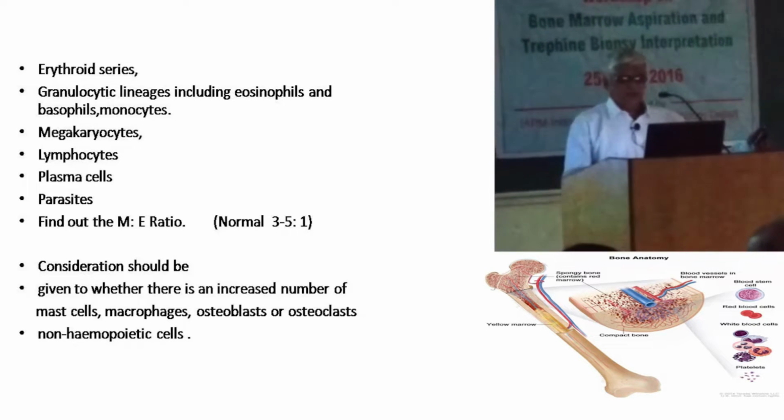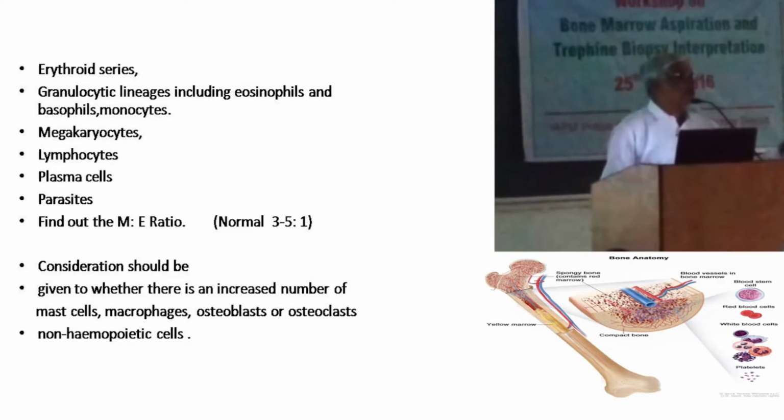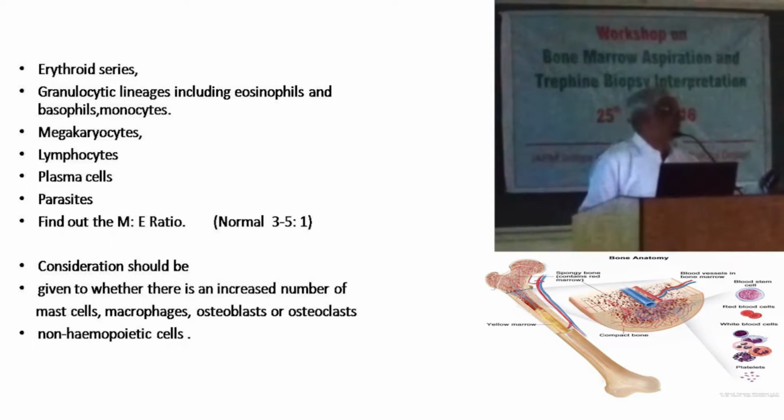Then of course mast cells and other macrophages, and then lipid storage diseases, of course those are macrophages which will be seen. Osteoclasts are seen many a time, and that I have seen in the bone marrow.